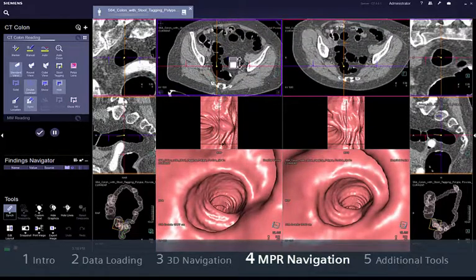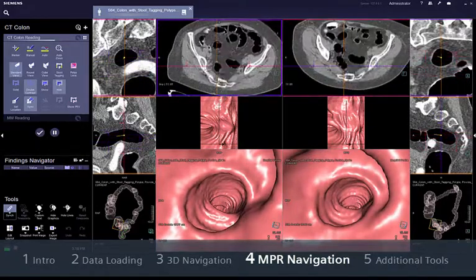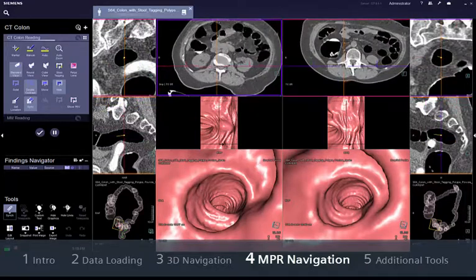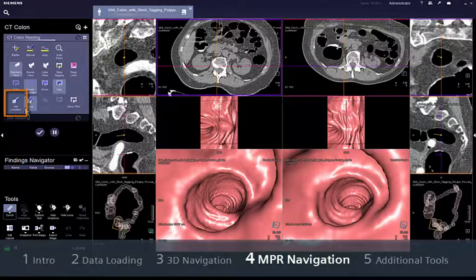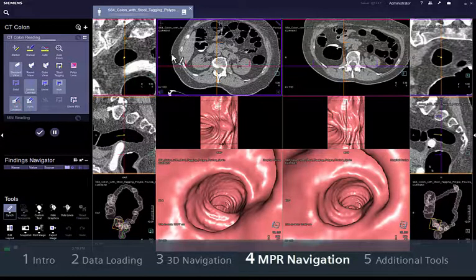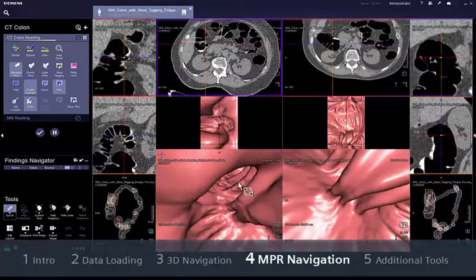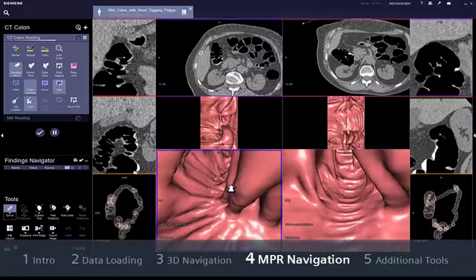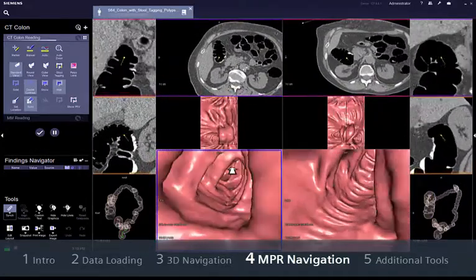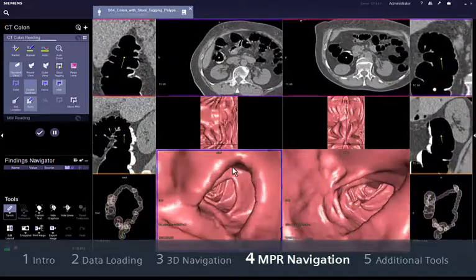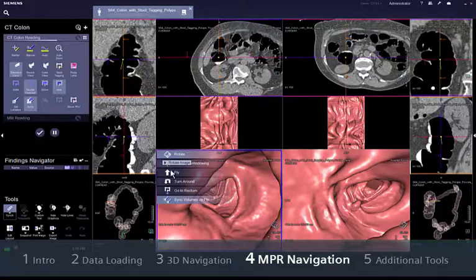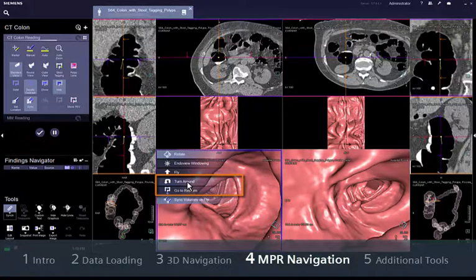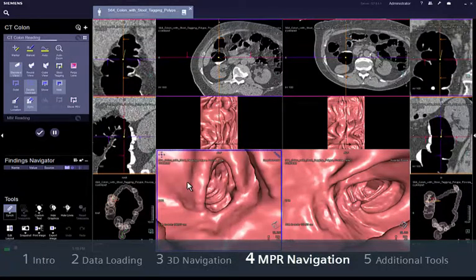If you want to navigate directly to another segment of the colon — for example if a stenosis occludes the endoluminal view — click on the Set Location option to reposition the virtual endoscope and draw a straight line in any MPR segment in the direction you want to look at. Setting the virtual endoscope is also possible in the global view segment. You can find other useful default positions for the endoscope in the upper left corner menu, for example Go to Rectum or Turn Around.